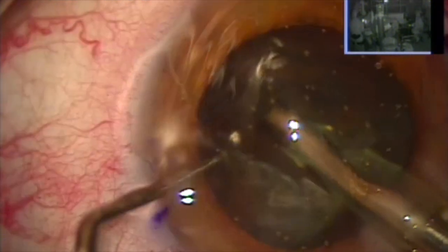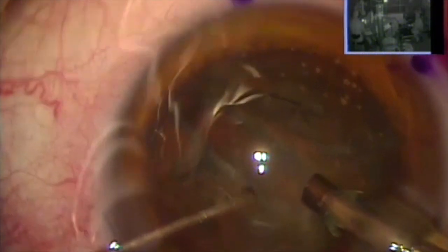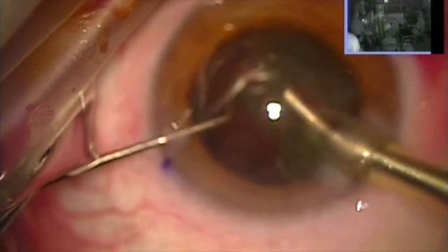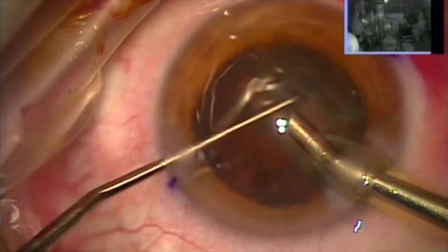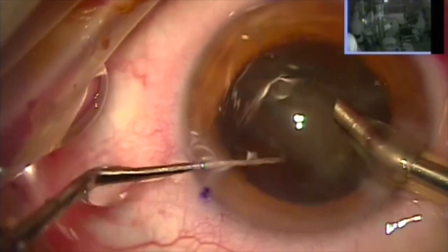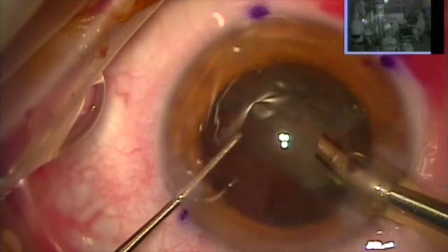So this is high-stress phaco surgery. I'm splitting the cataract. Fortunately, the cataract is not very dense — medium grade for our experience here in Athens, Greece. But we can all appreciate how opaque the lens is and how drastically the vision of this 72-year-old lady will improve. This is essentially a monocular patient since the other eye is at best 20/200.